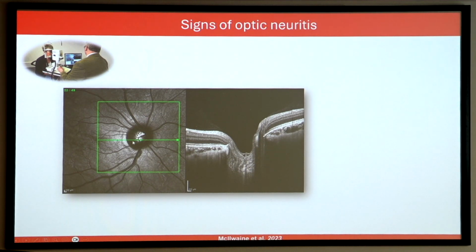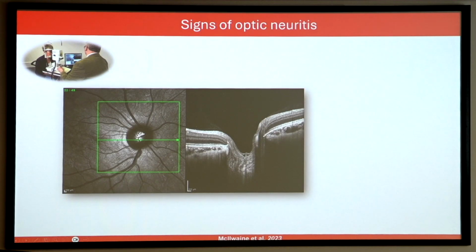And when you generate an optical cross-section of this part, which is really easy, with an imaging technology called optical coherence tomography, you can start seeing the nerve fibers that leave the eye, carrying the visual information and forming the optic nerve. Now, these are the nerves that are affected by optic neuritis, the major inflammatory event.